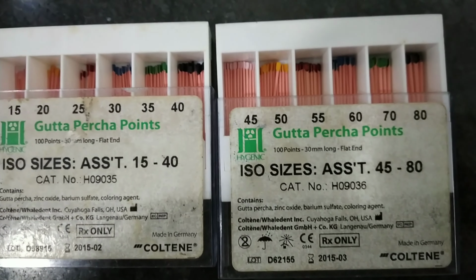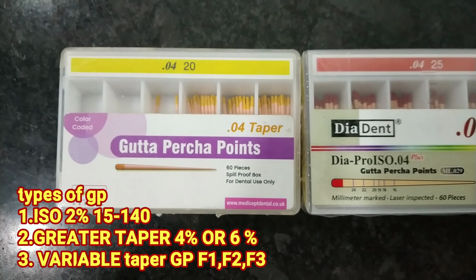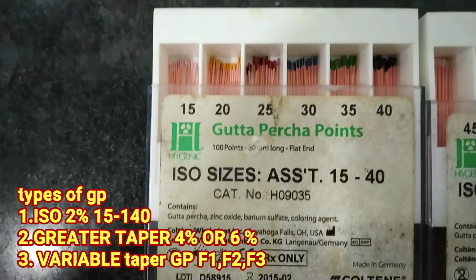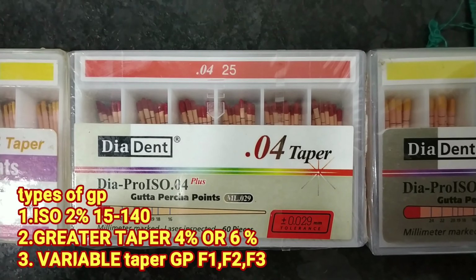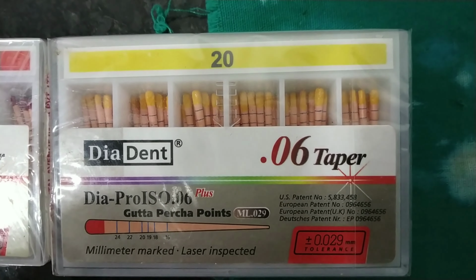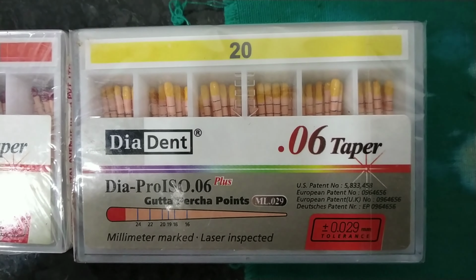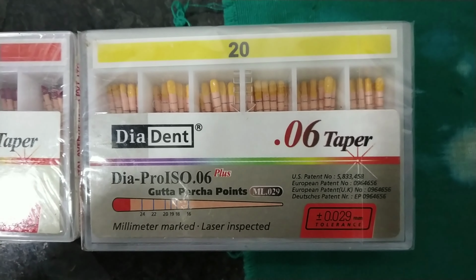So these are all 2% gutta percha. Now coming on to this is all 4% gutta percha. So you can see the size is a little bit thicker than the 2%. Now then you can see the 4% 25 gutta percha. And this one is the 6% 20 gutta percha. 6% 20 gutta percha files or GPs we have to use in the palatal canal of maxillary molars, as I have told you already, and on the distal canal of the lower molars.